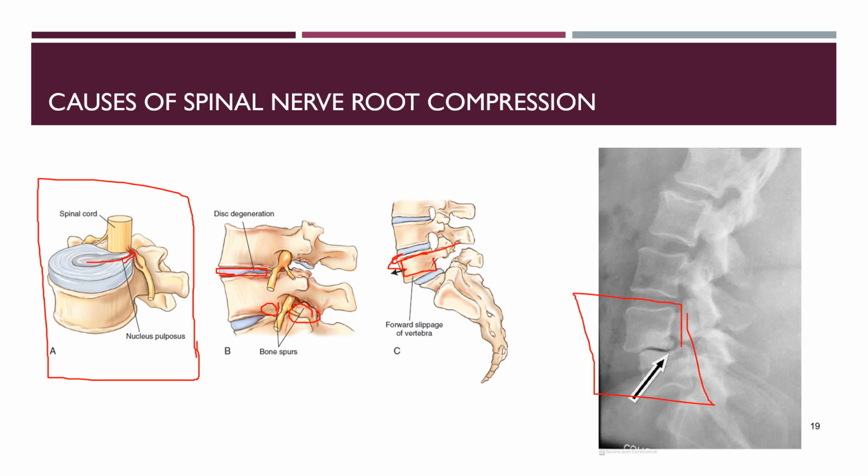There's been a lot of discussion on whether or not somebody who has a spondylolisthesis is appropriate for mechanical traction. But in my eyes, if it's bad enough, like this one here on the right side, this is somebody that I would be really hesitant to use spinal traction with, because technically this is instability of the spine.